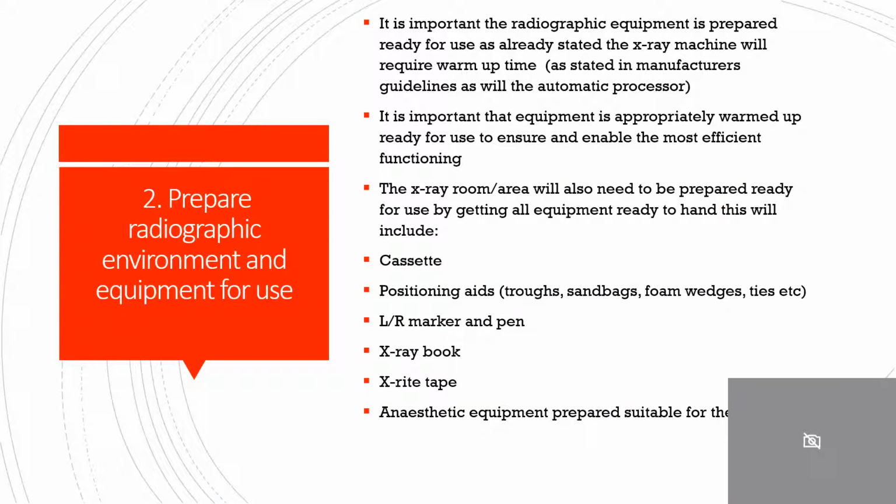Prepare radiographic environment and equipment for use. It is important that radiographic equipment is prepared ready for use. As already stated, the X-ray machine will require warm-up time, as stated in the manufacturer's guidelines, as will the automatic processor if you use one. It is important that the equipment is appropriately warmed up ready for use to ensure and enable the most efficient functioning. The X-ray room area will also need to be prepared ready for use.